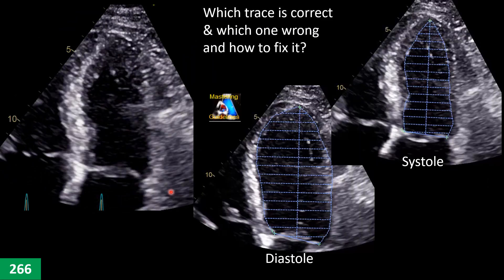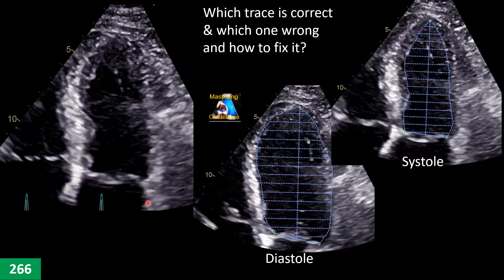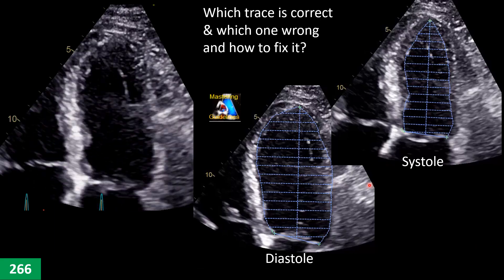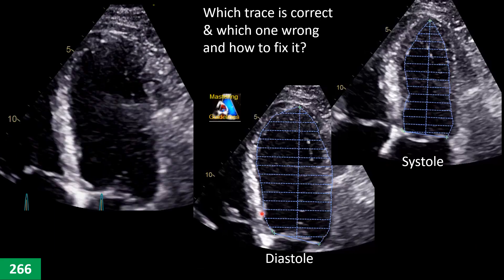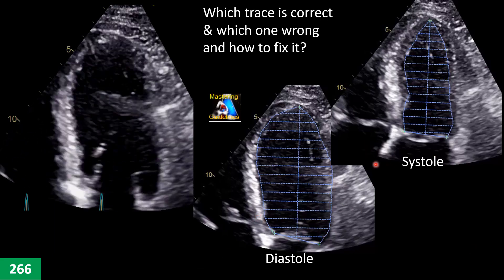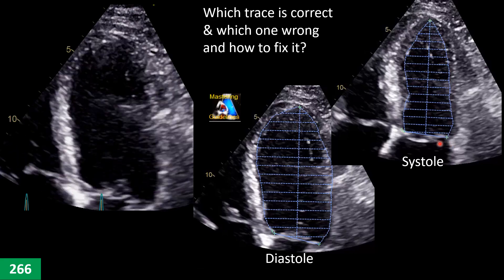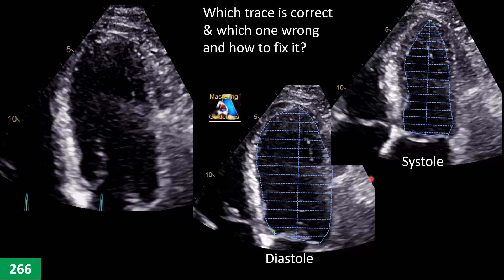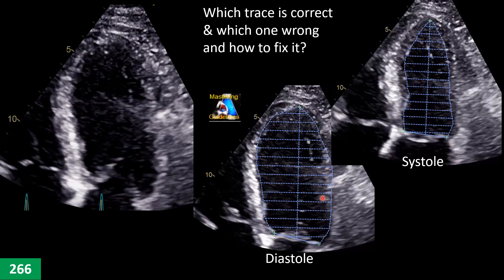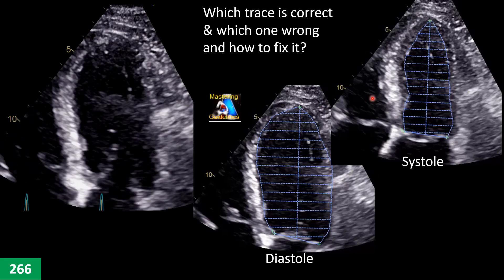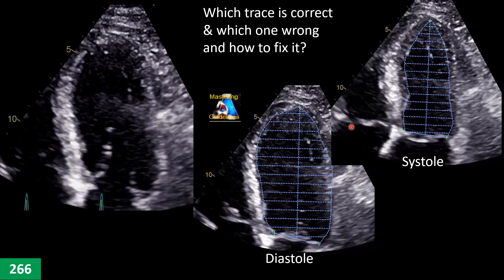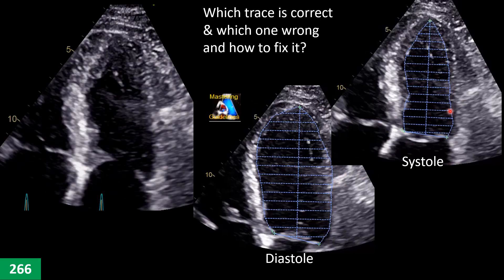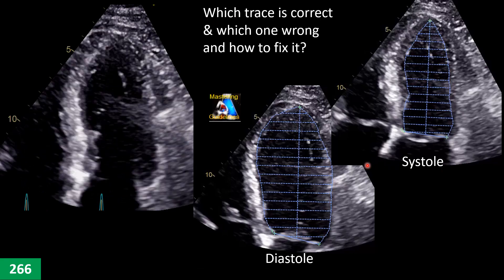Here we have another case — four-chamber with clear endocardium. The tech did diastole and systole tracing this way. Are any of them correct or wrong? What gives the impression of this type of tracing and measurement, and how can you fix it? What is the correct way?